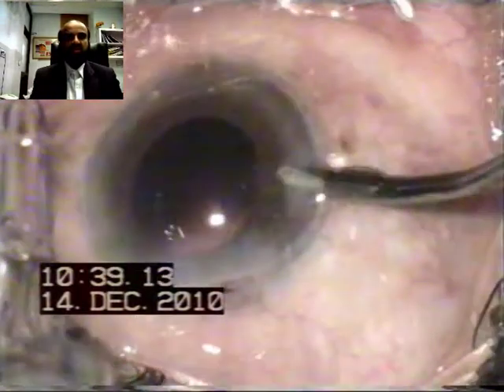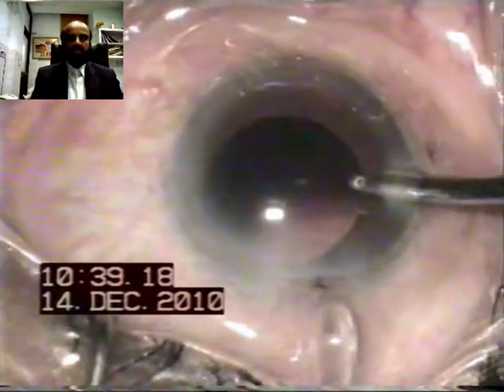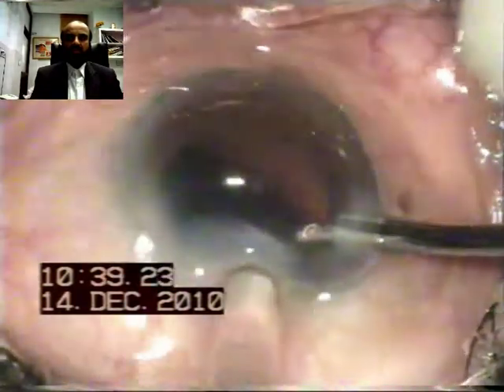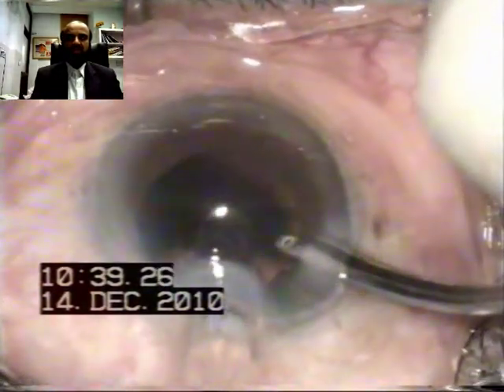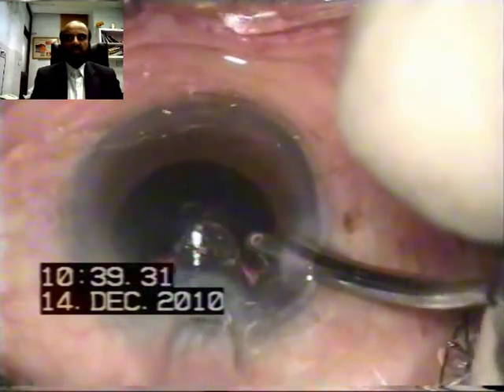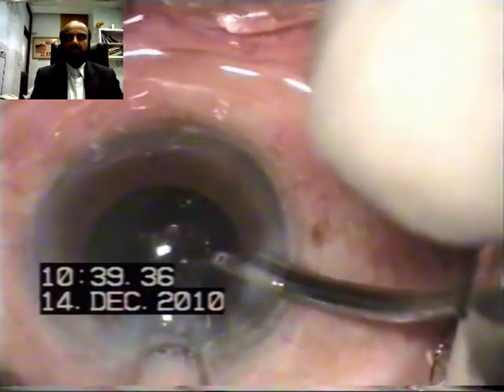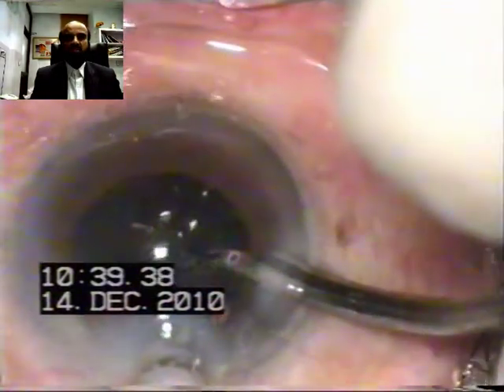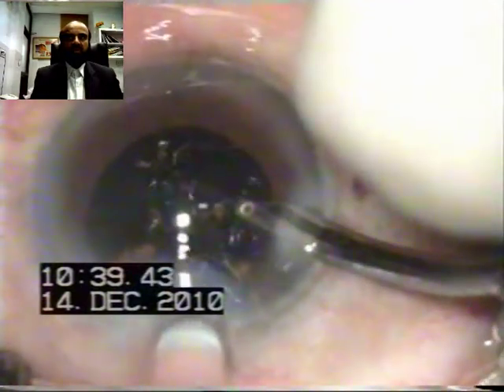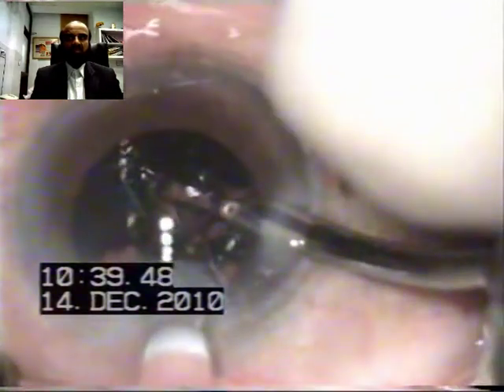The beauty of this system is that you don't need any viscoelastic — neither injected into the cartridge, nor even in the anterior chamber. As seen in this video clip, there is an irrigation line in one hand through the paracentesis, and the IOL is being injected through the phaco incision. The IOL is a four-haptic design.